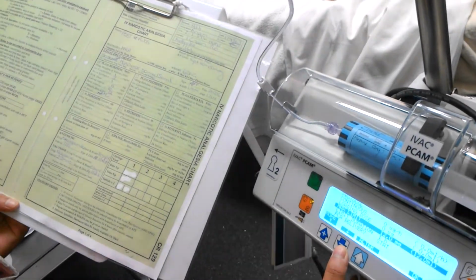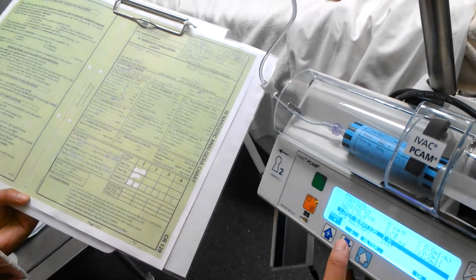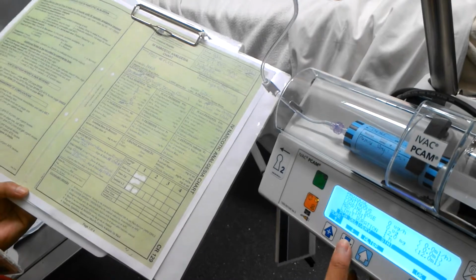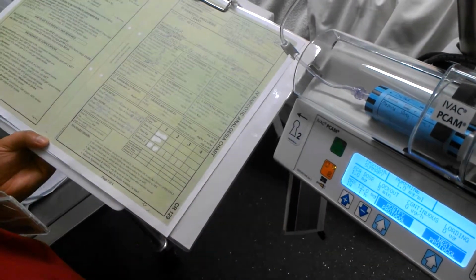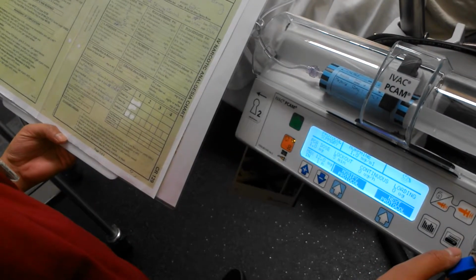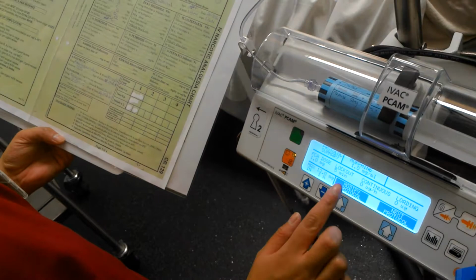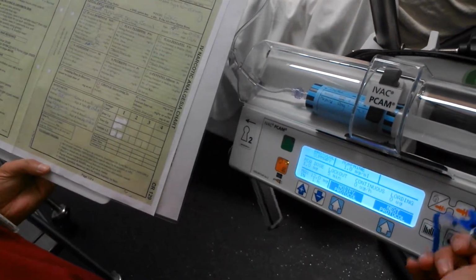Okay, limit duration, I keep it as is, so I know when to come back for the patient. PCA delivers that, then okay. Okay, so I know from here all of the criteria I've got here is what's correct from the medication chart, so I can start it now.